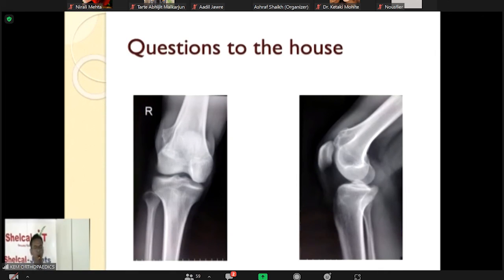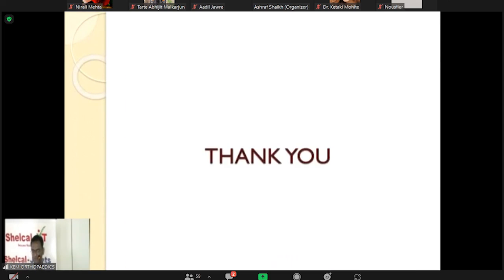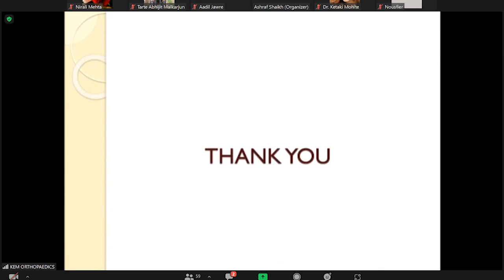Anyone wants to take this? Anyone? That's an osteochondroma. Check it in the lower part. Which type? More of the sessile type, not a pedunculated type. Easy. Correct. Posterior dislocation with a wall fracture. Okay, that's all for you.